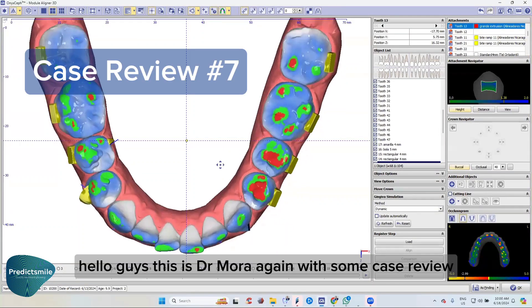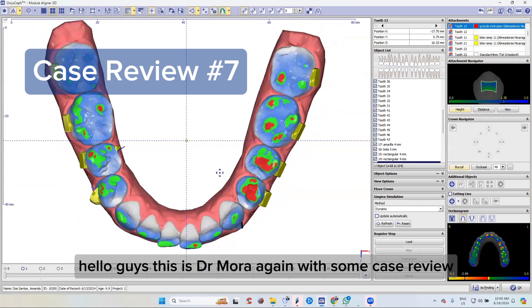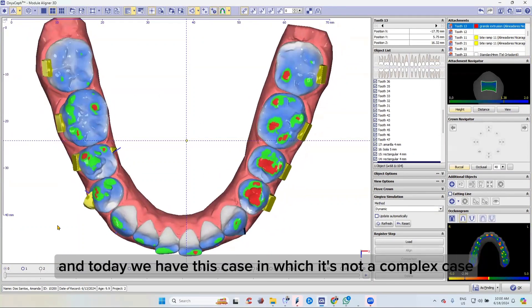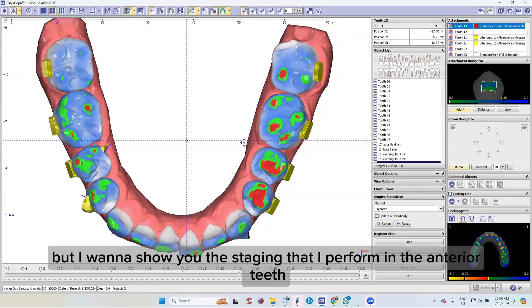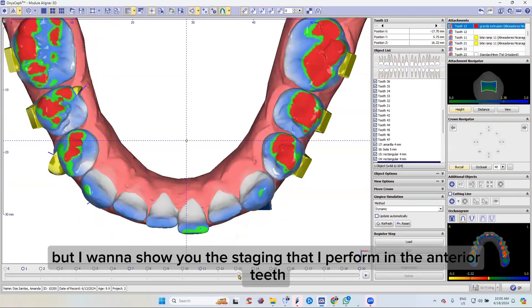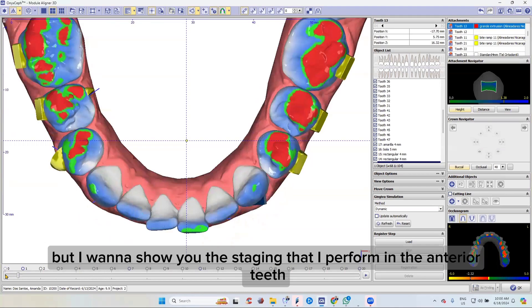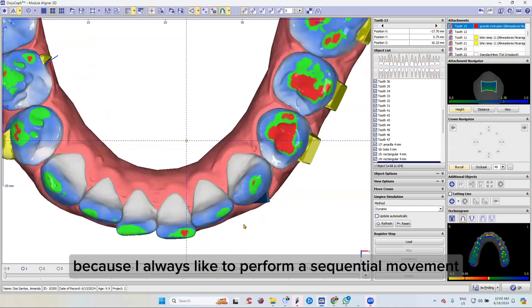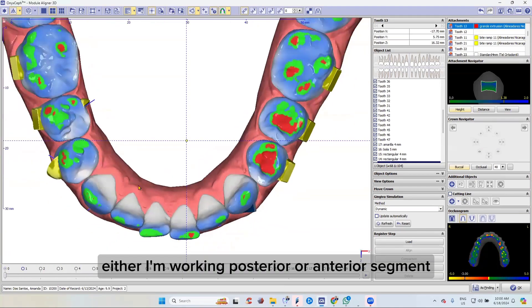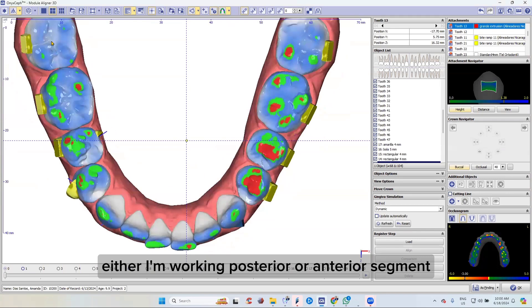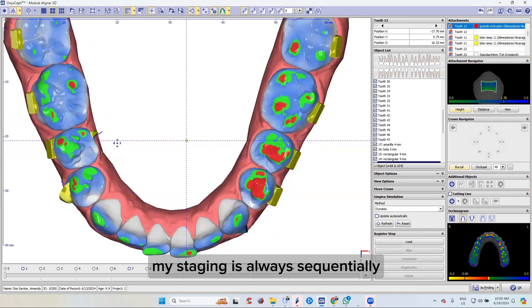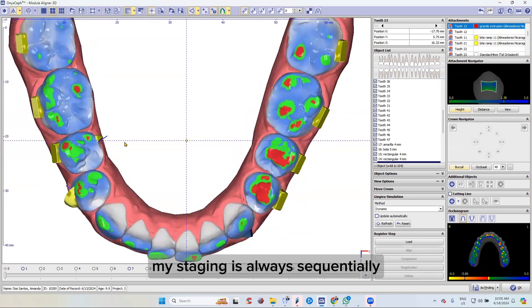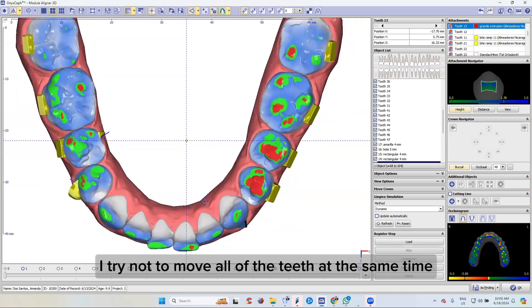Hello guys, this is Dr. Mora again with some case review. Today we have a case that's not complex, but I want to show you the staging that I perform in the anterior teeth because I always like to perform a sequential movement. Whether I'm working in the posterior or anterior segment, my staging is always sequential — I try not to move all of the teeth at the same time.